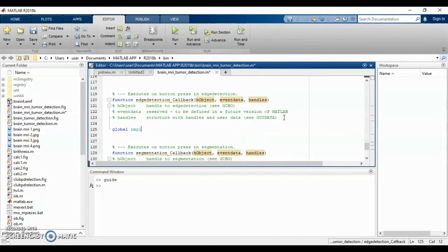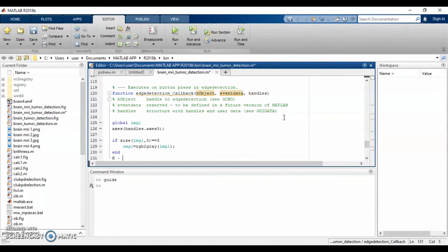So the third push button will be used for edge detection. Before inserting the function for edge detection, we will use the global command to retrieve the previous image again. And to show the image in the third axis, we will type the command axes(handles.axes3), and the median filtering function will then be used also.